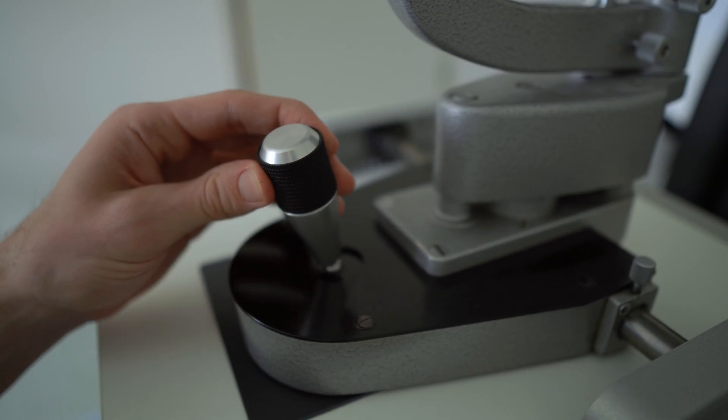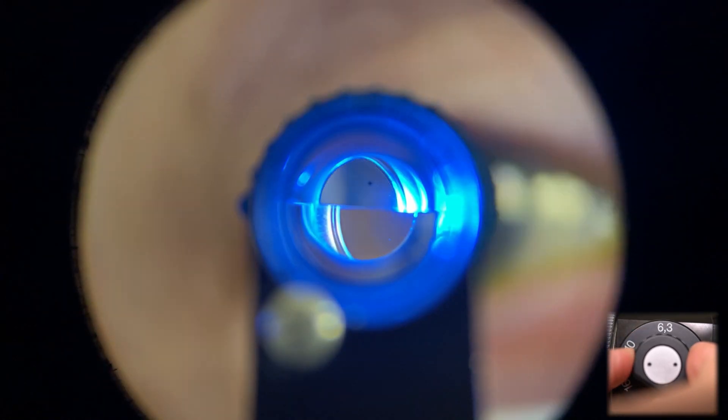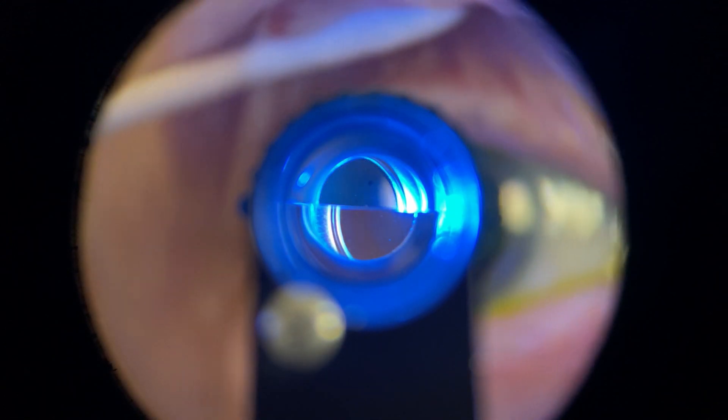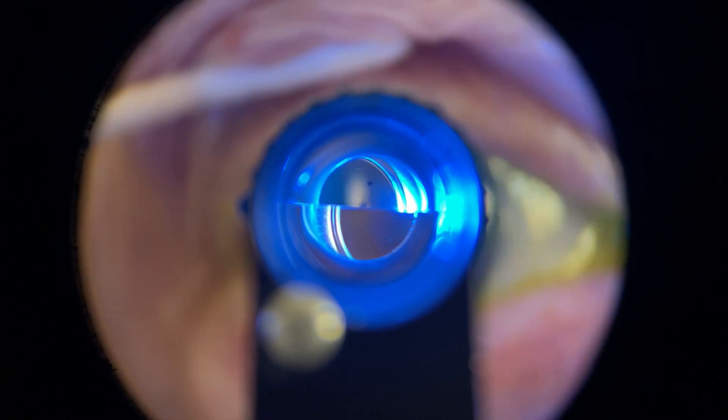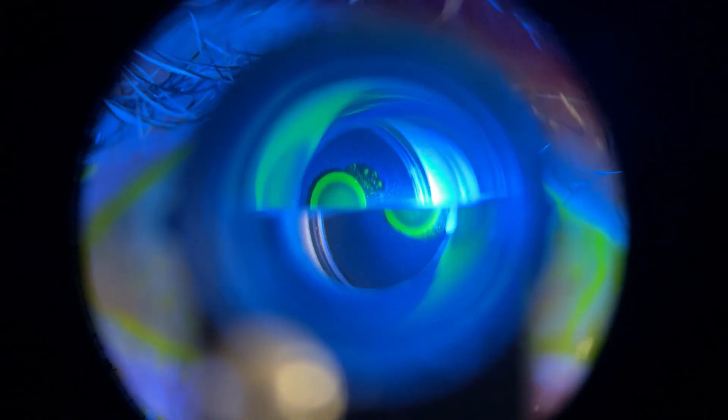A lot of beginners struggle at this point — you can see the measurement prisms perfectly sharp but the patient's eye is completely blurred out. This can be very disorienting and make you scared that you're going to hit the patient's eye too fast and hurt them. Here's a little tip: turn down the magnification of your slit lamp to 6.3x. This allows you to see more of the patient's face and get a greater depth of field, so you can safely approach the cornea and then switch back to 10x magnification once you make contact.